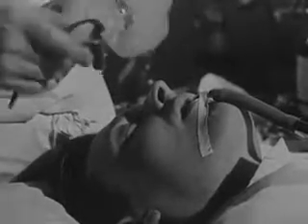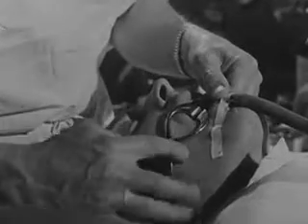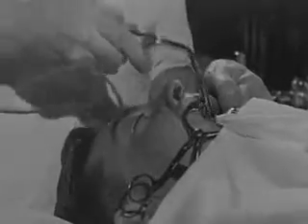When there is any likelihood of blood reaching the larynx, it is necessary to pack the pharynx carefully. Packing is deposited in such a way as to hold the soft palate against the posterior wall of the pharynx, thereby encouraging the soft palate to fulfill one of its natural functions.